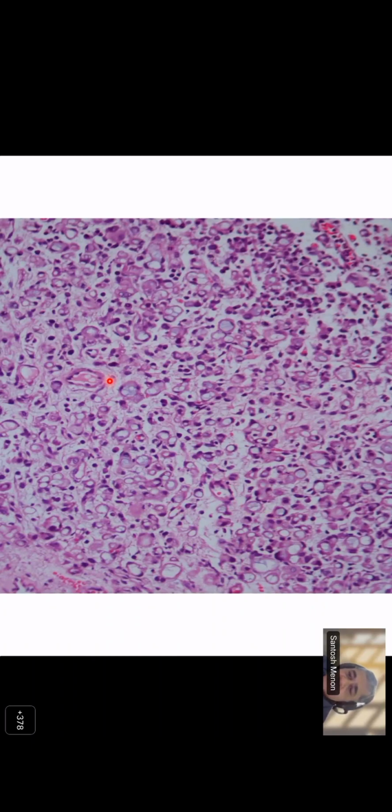A person is requesting that field size should be mentioned, whether it is 10x or 40x. Some of the people requested. Sorry, I have not mentioned that, and I really don't remember. These are old cases of mine, so that's fine. Whatever it is, I think a signet is always a signet, whether it is 4x or 10x or 20x. A signet remains a signet, as far as the pathology is concerned.